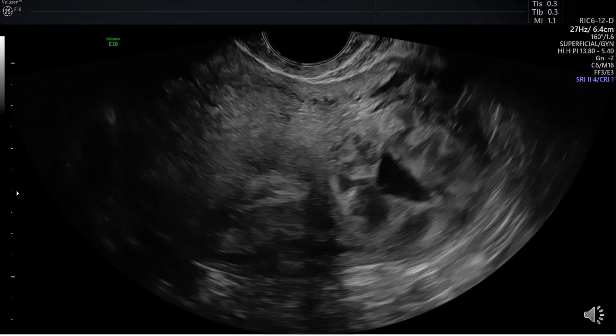Sometimes visualization of the interstitial line is not present. Visualizing a hypoechoic area between the interstitial pregnancy and the endometrium can also help in showing the distinction between the two structures, as shown here.